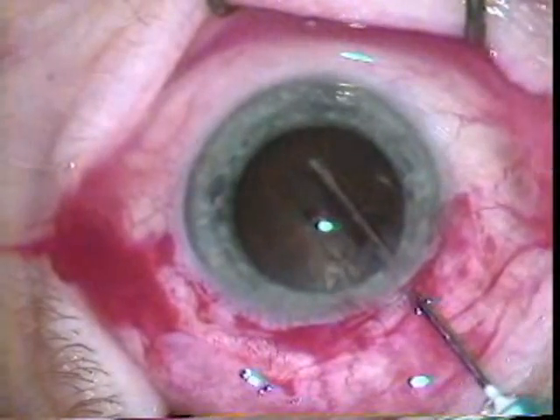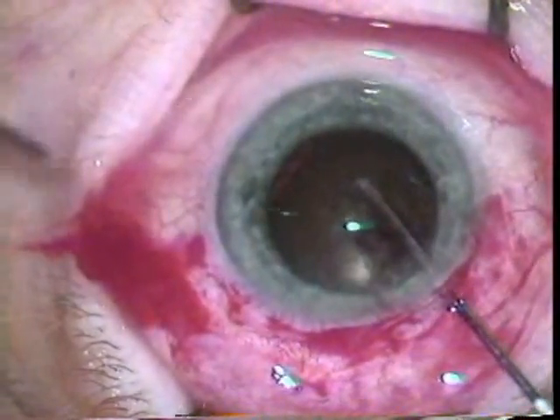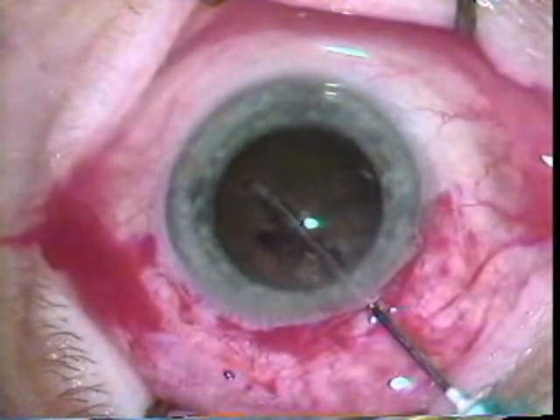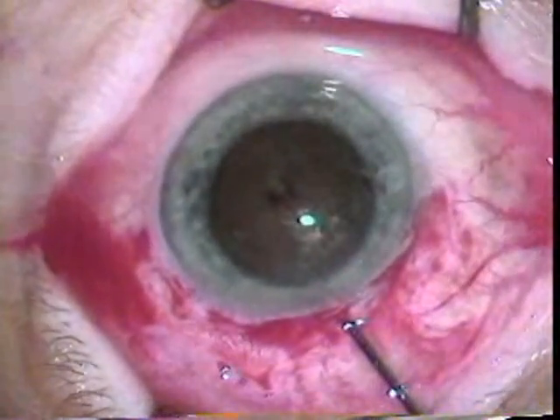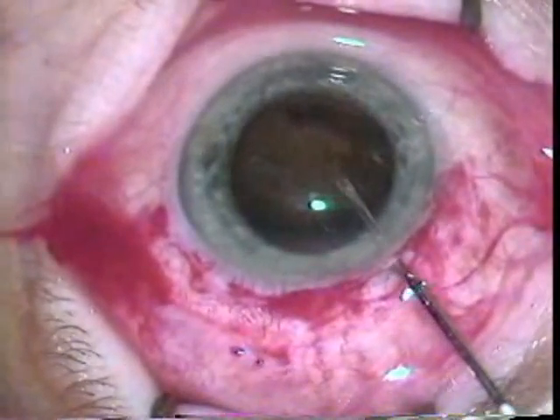Now with the cystotome he's rocking the lens free. No hydrodissection is done with Dr. Kolder's extracap technique. The last motion is to put the lens up and rock it such that it's ready to come out through the wound.